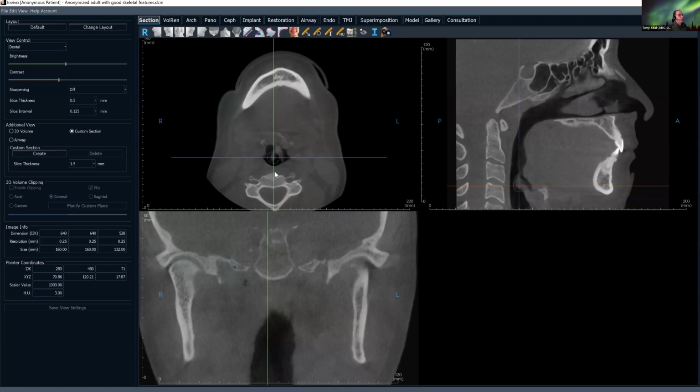I generally draw an imaginary triangle. In fact, I might just do it since we're doing this here, to about the midline here and right in here. So this area here is where all those structures can and do fall. The five structures that I named, and so you have to look out for those in that area.